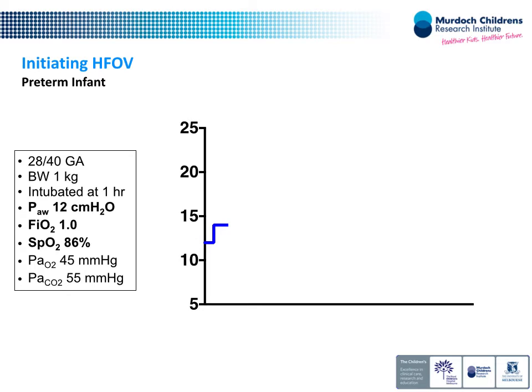So are you doing the X-ray to get the right mean airway pressure, or to work out that you don't have an alternative pathology like a pneumothorax? Yeah, mostly to rule out any other complication for why the baby's not oxygenated. And then we have some idea of how the lungs are expanded, or how the volume is, or whatever.